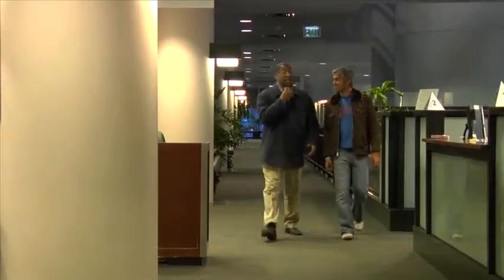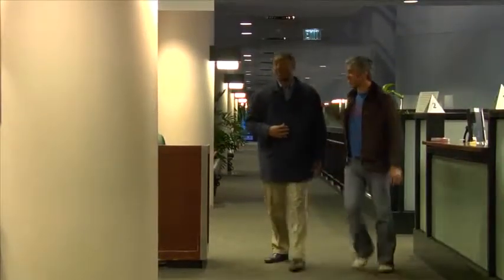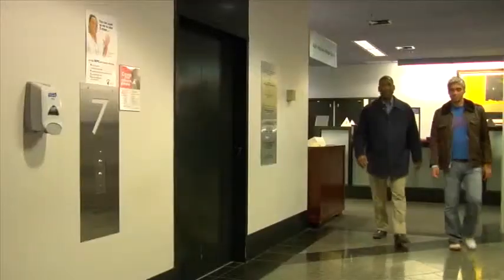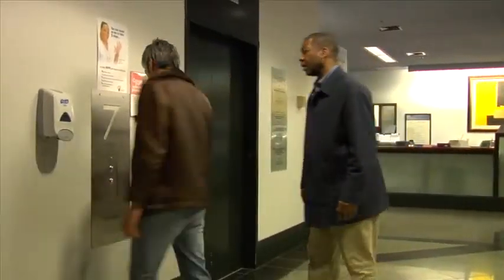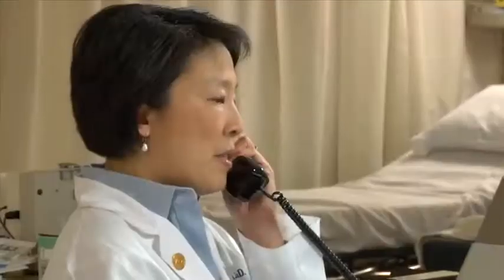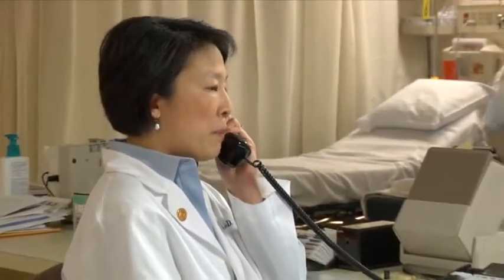By the time you're ready to go home, you'll feel more alert. However, you'll need to have a friend or family member take you home, and you should plan on resting for the remainder of the day. Occasionally, minor problems may persist, such as a mild sore throat, bloating, or cramping. These should disappear in 24 hours or less. In a few days, you'll hear from your doctor with additional information, such as results of the biopsy. This is the time to ask any follow-up questions.